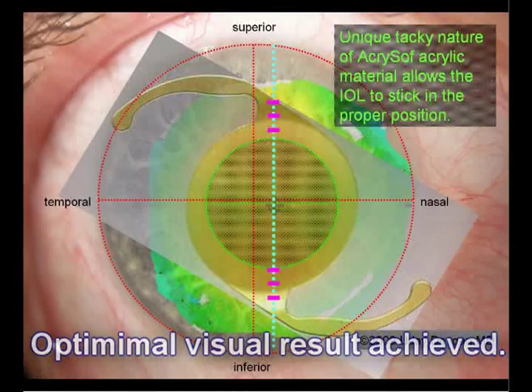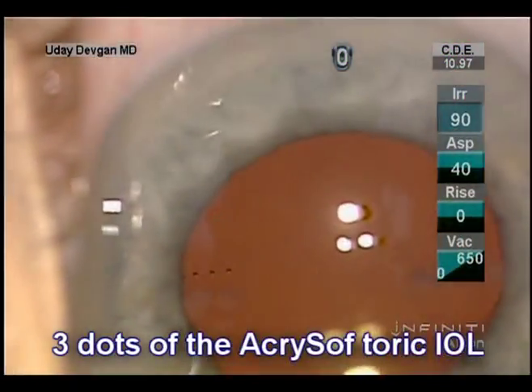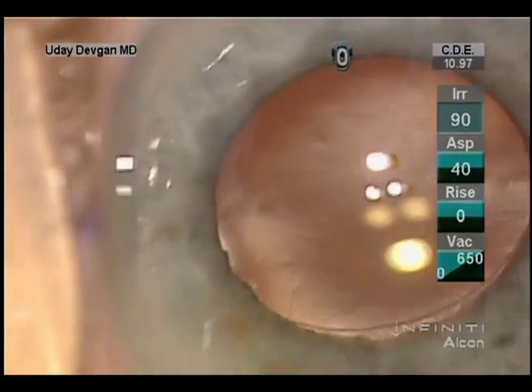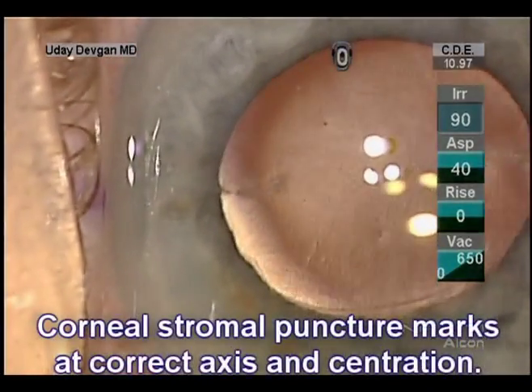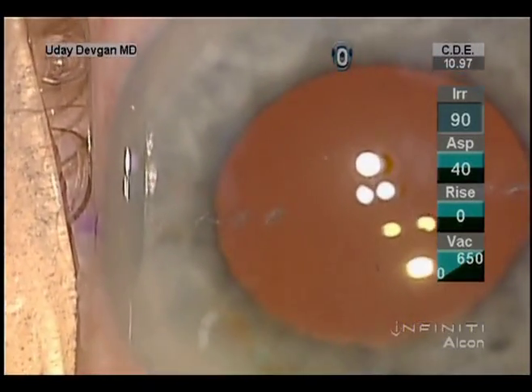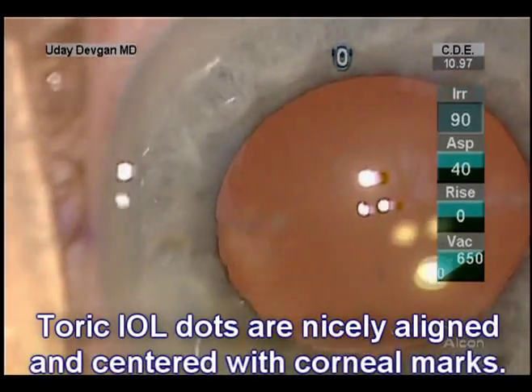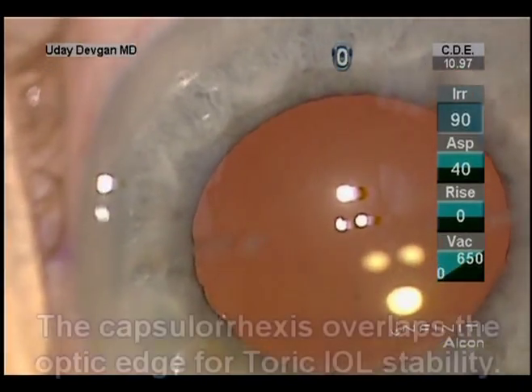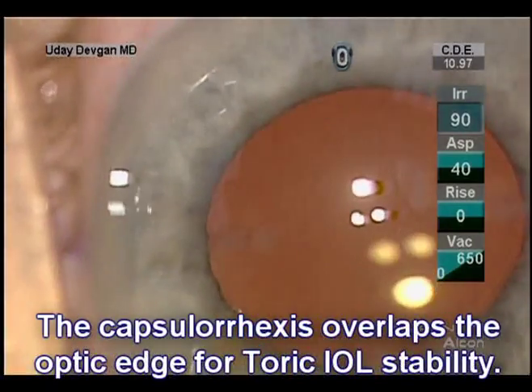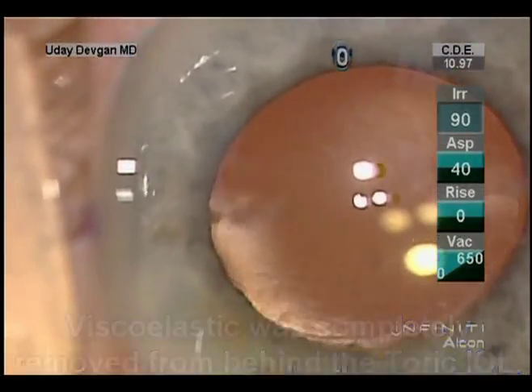The lens tends to stay in this position. At the microscope, we see the three dots of the Acrosoft toric lens. If you focus the microscope up, we'll notice the corneal stromal puncture marks at the correct axis and centration. The toric IOL dots are nicely aligned and centered with these marks. We have a capsulorrhexis edge which overlaps the lens for stability, and we removed all the viscoelastic.